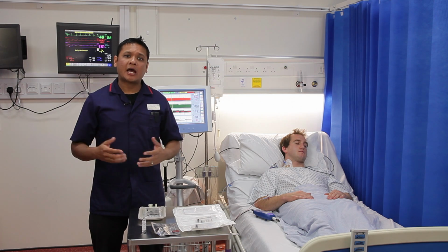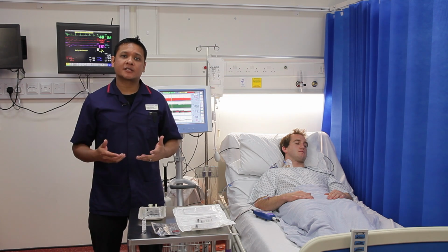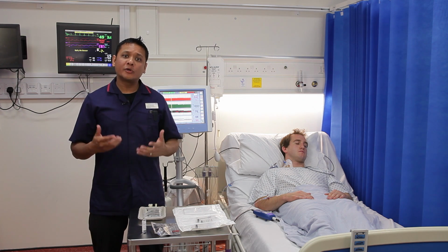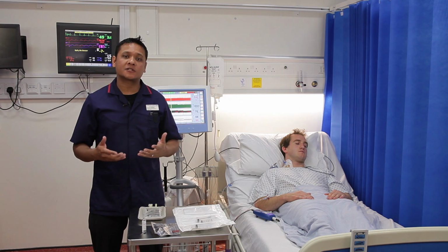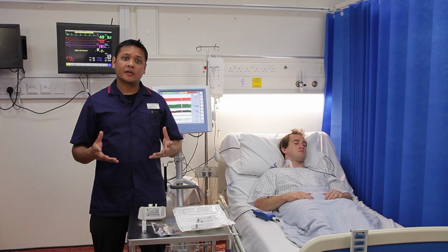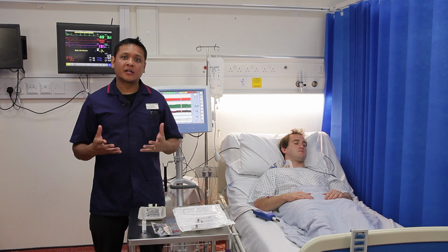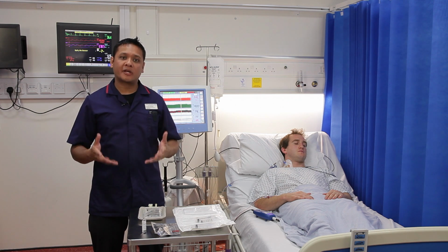In this section, I'm going to give you some tips and tricks to ensure a smooth setup and calibration. Before we do that, a good rule of thumb is to check all cables and connections before you use the monitor. Okay, if you can't see any blood pressure data when you first switch on the monitor, then check the cable that connects the LiDCO Plus to the primary patient monitor.